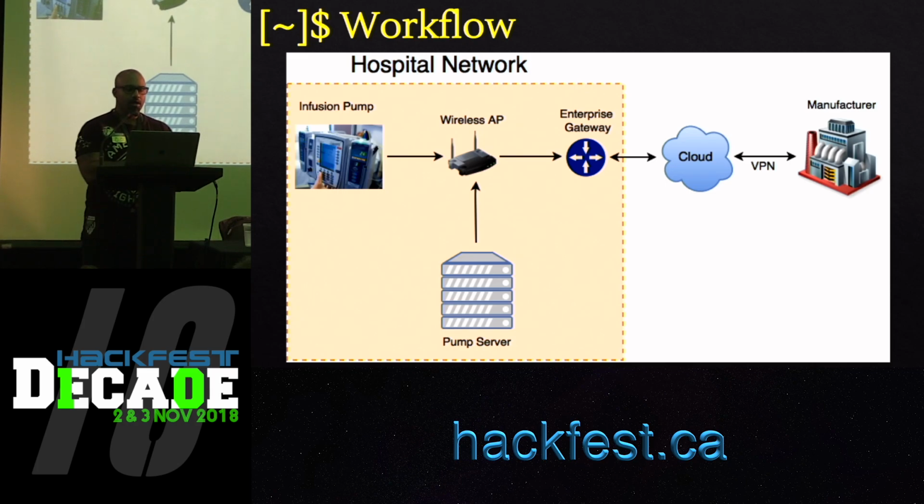And then if the hospital decides to share the data collected from the infusion pump, they can do so by pushing the data out onto the cloud server, or giving researchers access via VPN. So we've seen both kinds of cases.